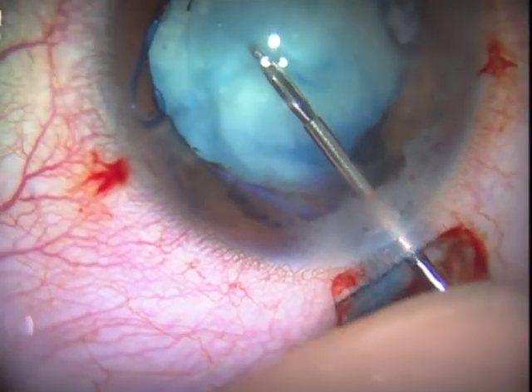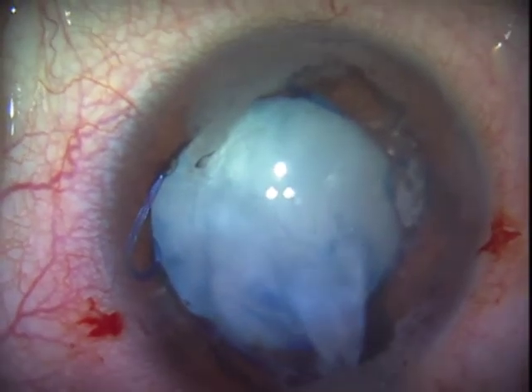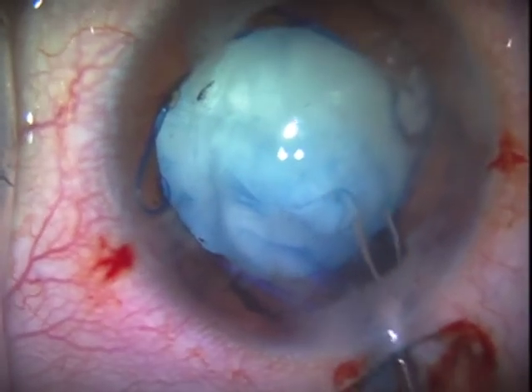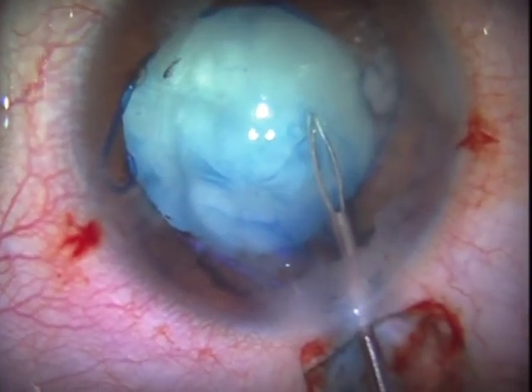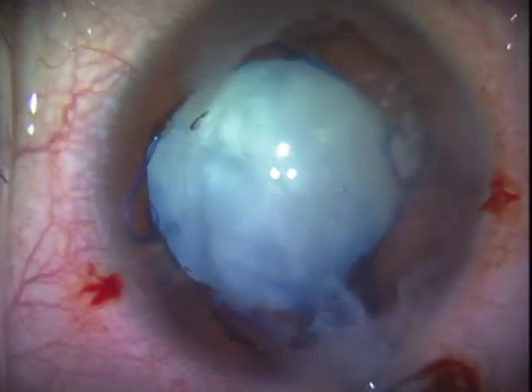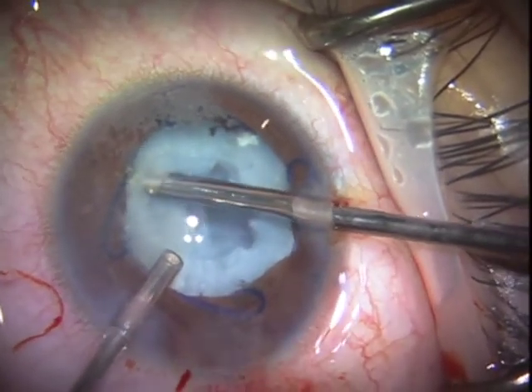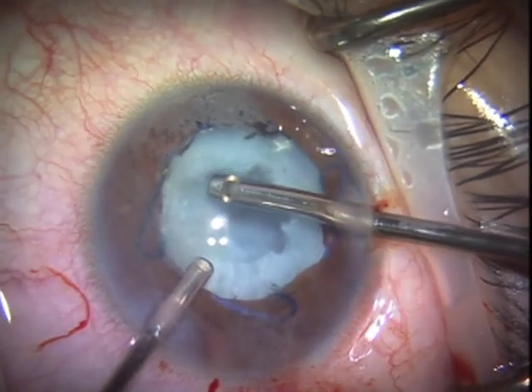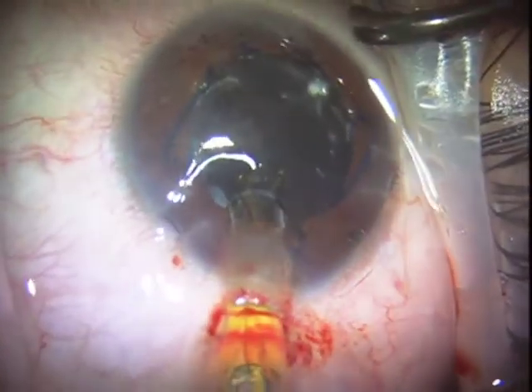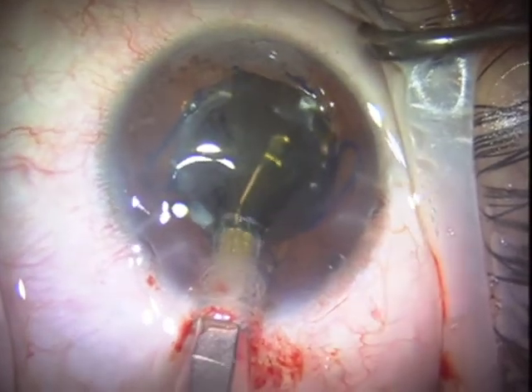It will also be interesting to see if femtosecond lasers are able to manage these fibrotic capsules. It appears that we have this capsule free — maybe there is a tag, or is it just attached to the nucleus. We now have the capsule opening complete, and we're going to enlarge this capsule opening with the vitrector to make sure it's ready for in-bag placement of the IOL.